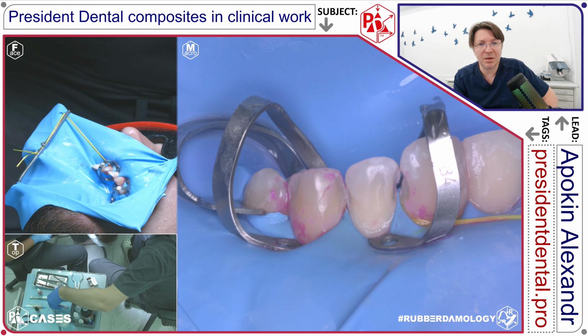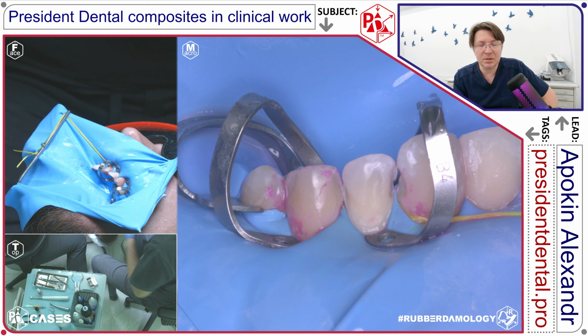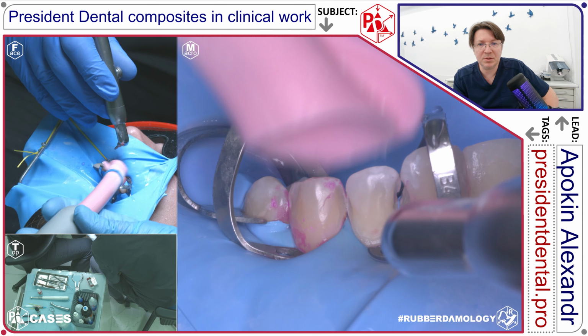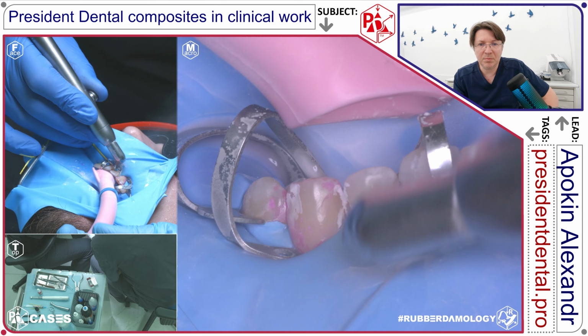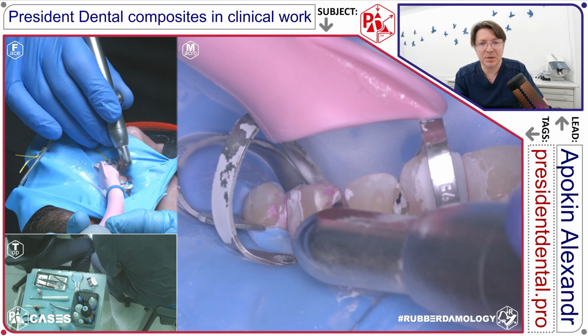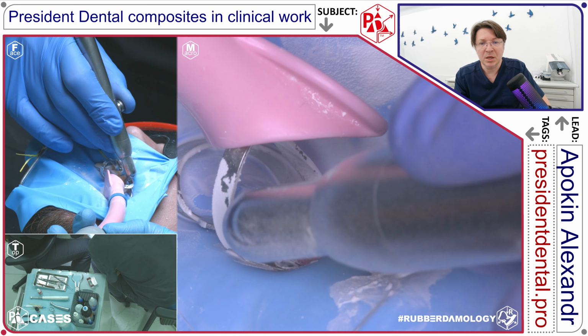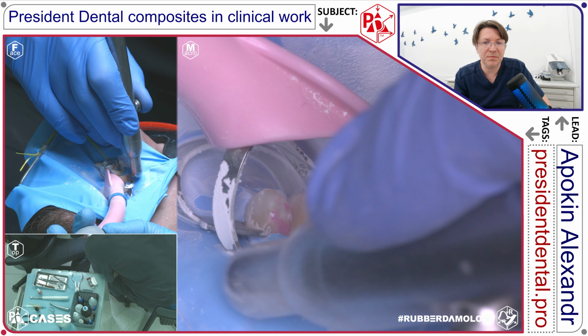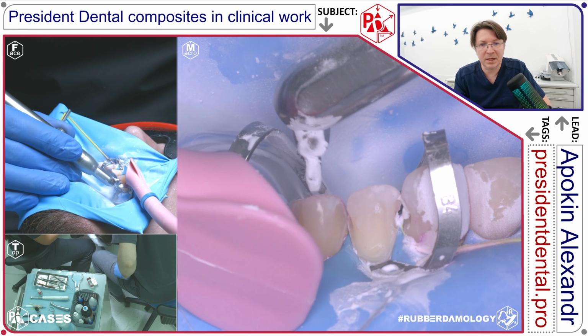The additional camera is the face camera at the left side. Now you can watch materials, instruments, working with the rubber dam field and some common view. And of course I put the top camera, where you can see my working table with instruments, curing lamps, clamp forceps, and some other instruments that I use in my daily work.